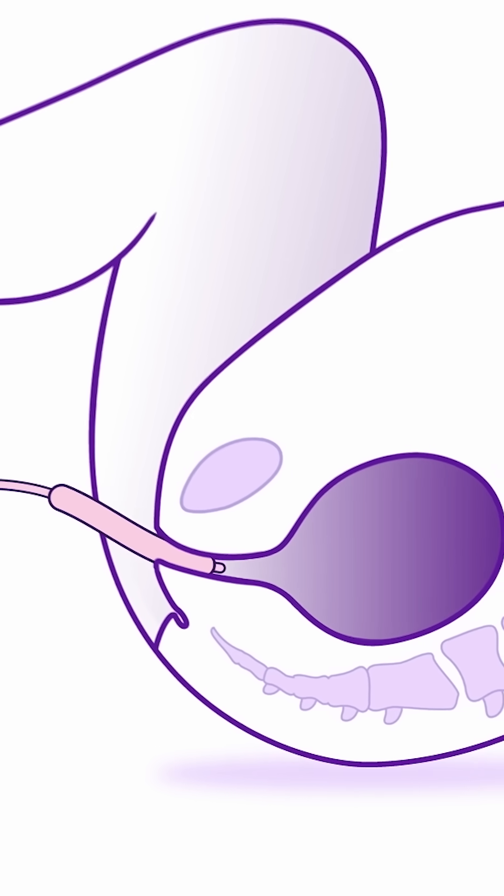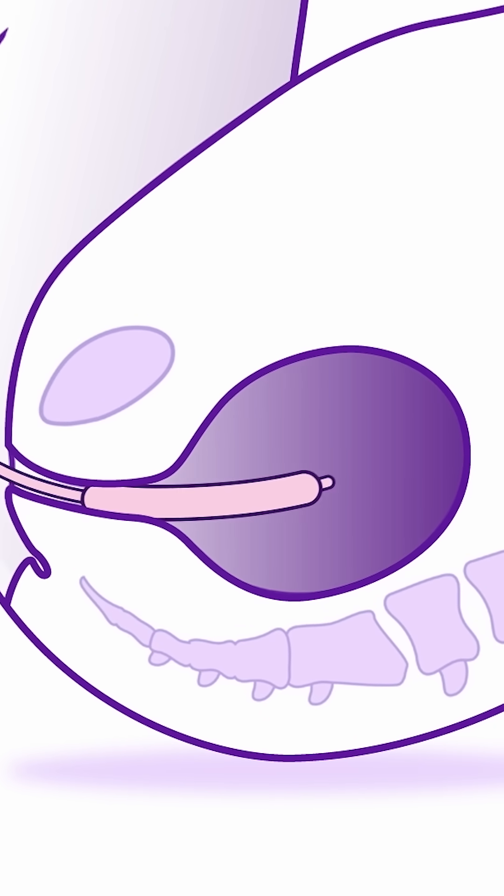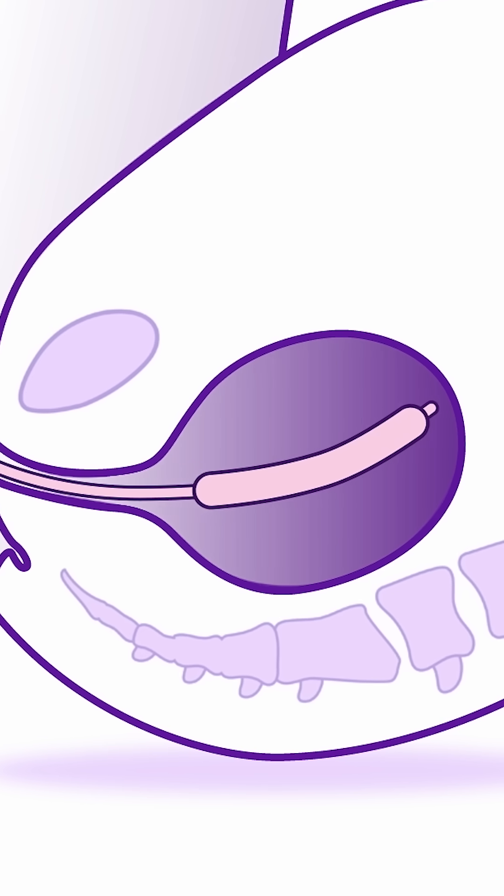The first step is to place the Bakri balloon. I'm going to gently insert through the vagina, through the cervix, and into the uterine cavity.